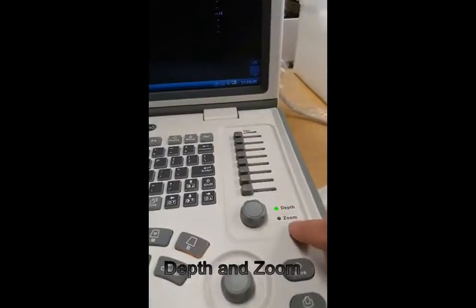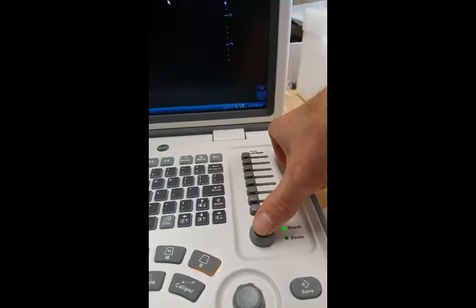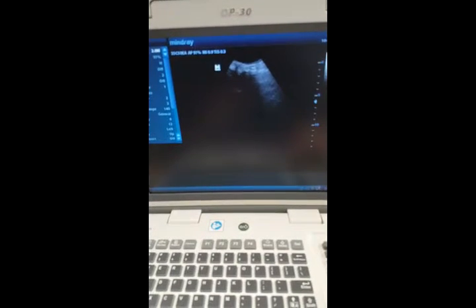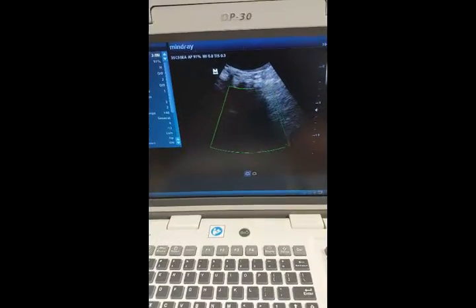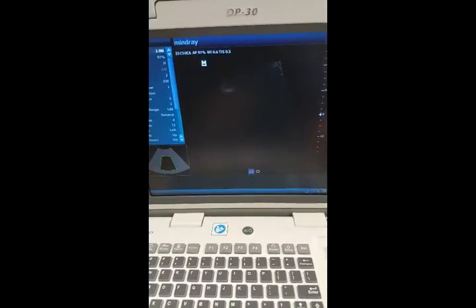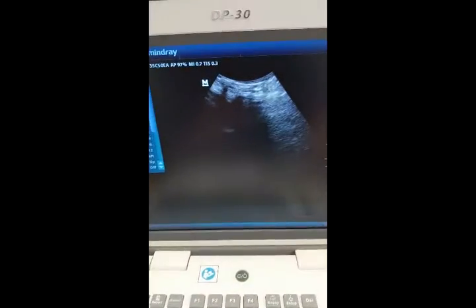This knob here does either depth or zoom — press the button to switch between depth or zoom. Once you're on depth, you can adjust that to go deeper or to go shallower. And zoom is just to zoom in and it'll zoom in on the specific spot. To exit it, just press the depth button again.